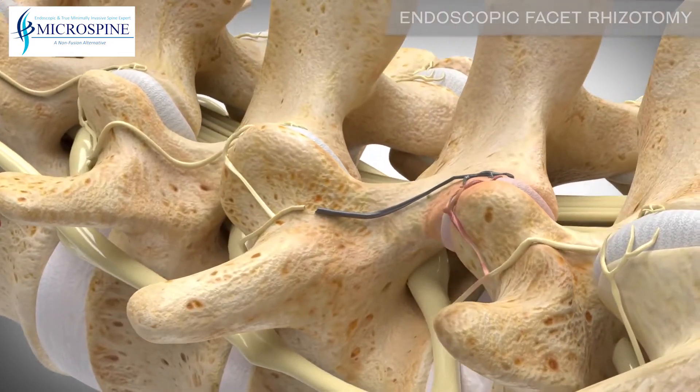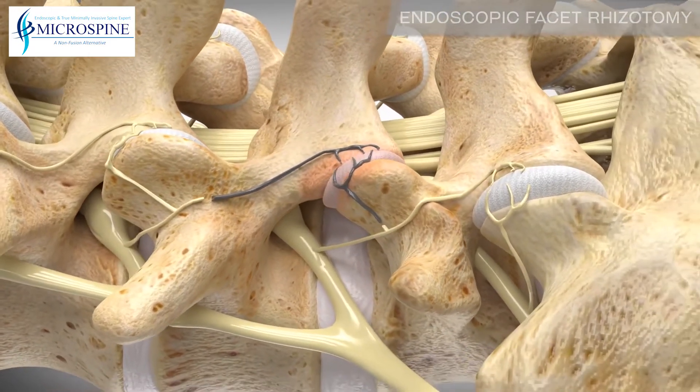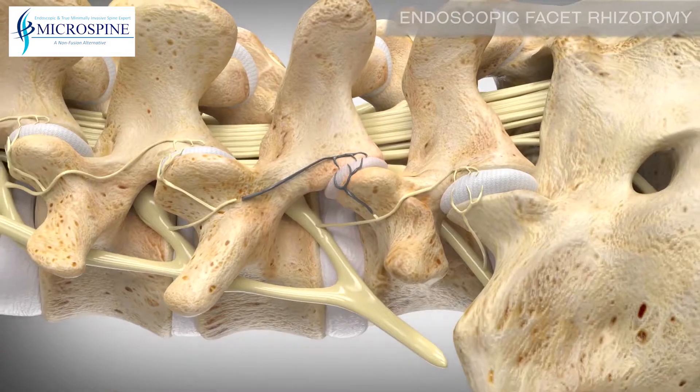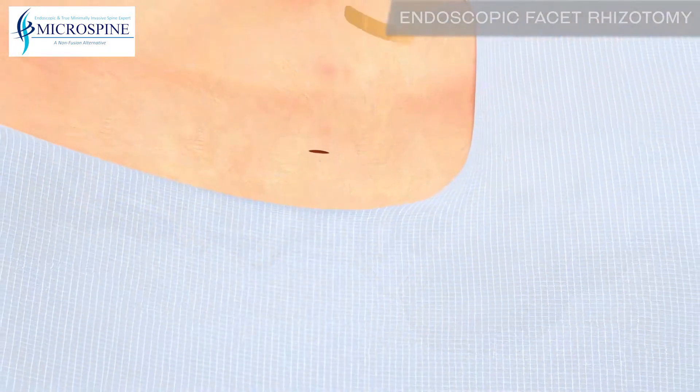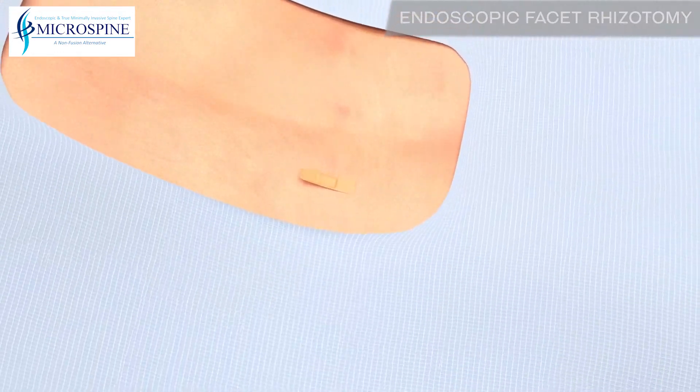The process is then repeated for the adjacent level. Once the nerves are isolated, the pain generated by the facet can be significantly reduced. This procedure can be done through a single incision and closed with a small bandage.